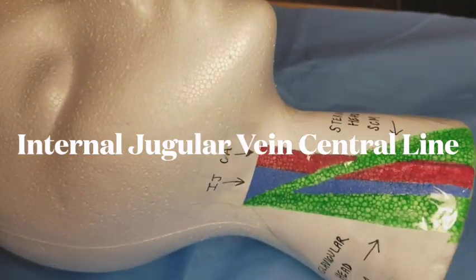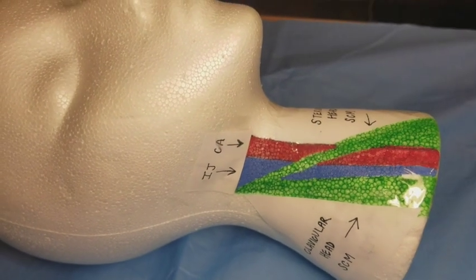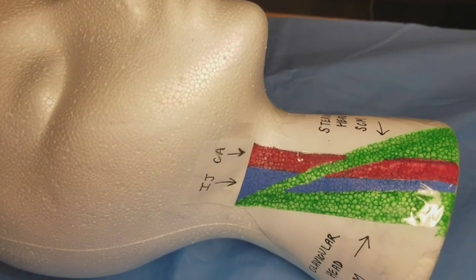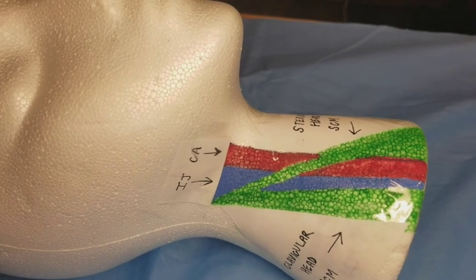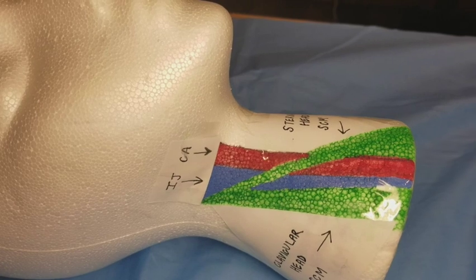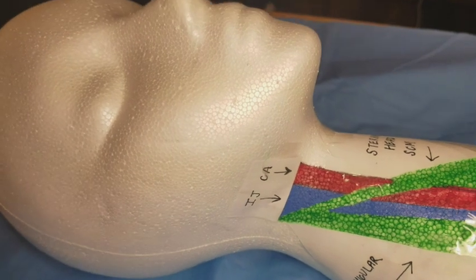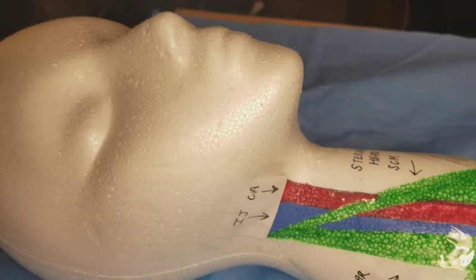Hi everyone, today I wanted to talk to you about the central venous catheterization procedure commonly done in the emergency room setting. So the indications for this procedure are central venous pressure monitoring, emergency resuscitation, hemodialysis, parenteral nutrition, pulmonary artery catheterization, and medication delivery. The contraindications for this procedure are infection at the site of insertion, thrombosis of the vein you are trying to cannulate, and coagulopathy.